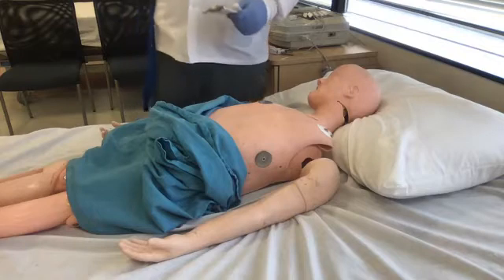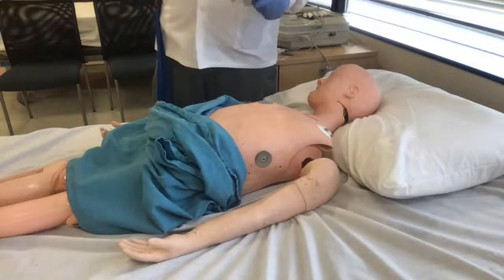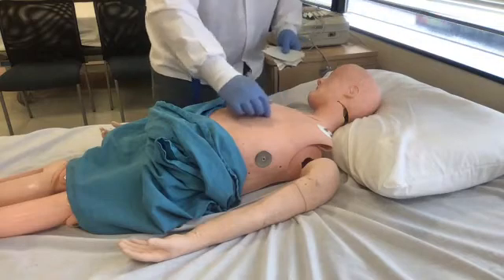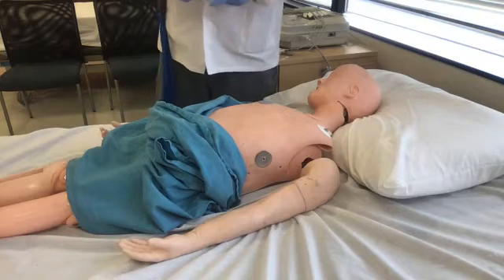No, because again, you're looking at the protocol. If you look at the protocol too closely, and remember, you just need to clean the area that the electrode will stick on, right? But it was funny.